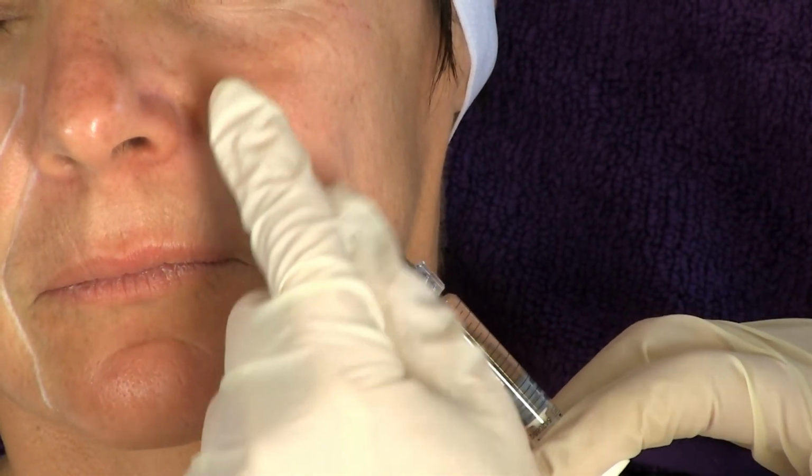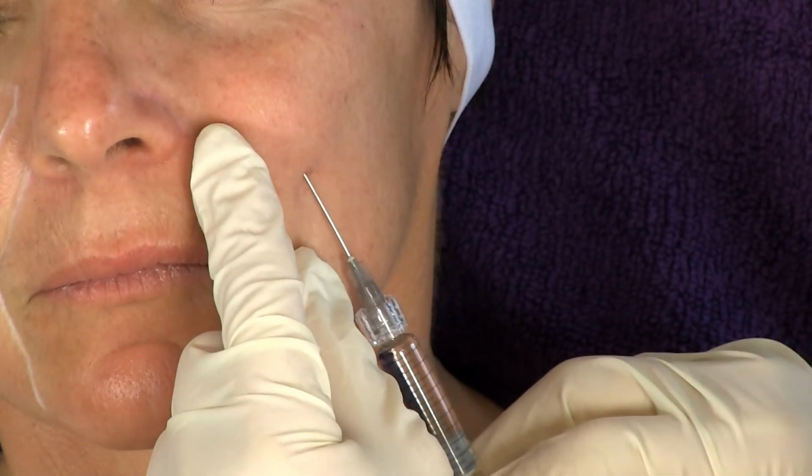Gently shape and mold the material to the desired cosmetic effect.